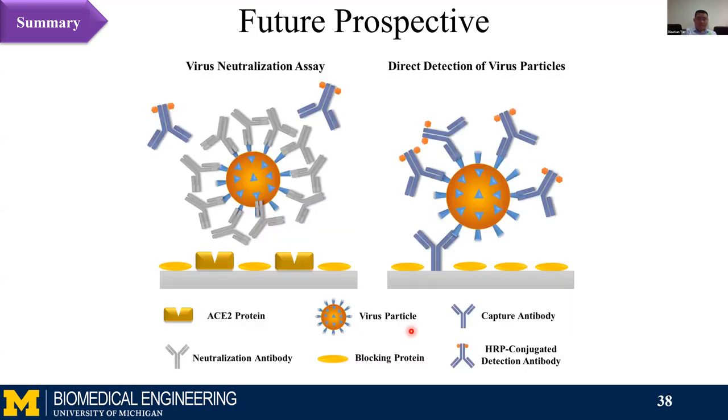So in the future, we are also planning to do a few more things. First is evaluating more potential calibration antibodies. D006 is definitely a very good antibody, but it's still not a perfect antibody. The optimal antibody for the convalescent plasma therapy is an antibody that's isolated from recovered COVID-19 patients. So if we can identify a good calibrator antibody in the future, we can use that as a calibrator antibody. It's a very easy replacement.